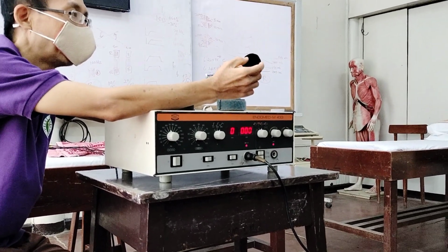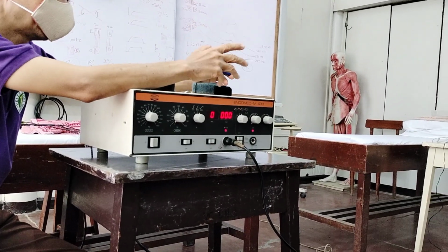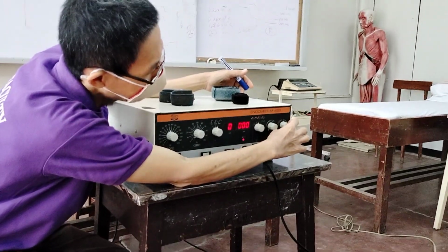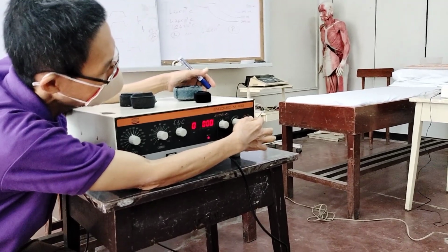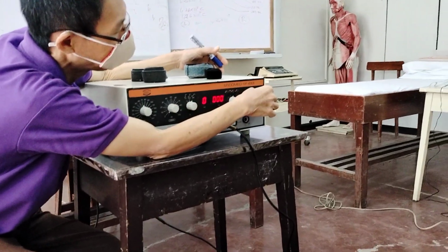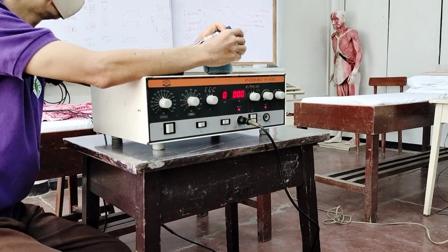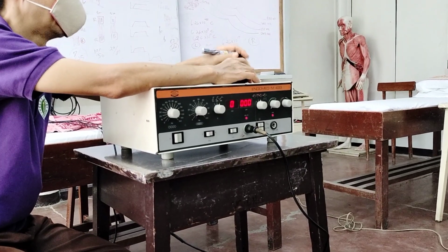So if the patient feels more on the red, you have to transfer the current more towards the black. How do you transfer that? You adjust this knob going towards the black here. It widens there, which means your current will now be more transferred towards the black. It reduces the red and increases the current on the black, so the patient no longer feels too much on the red.